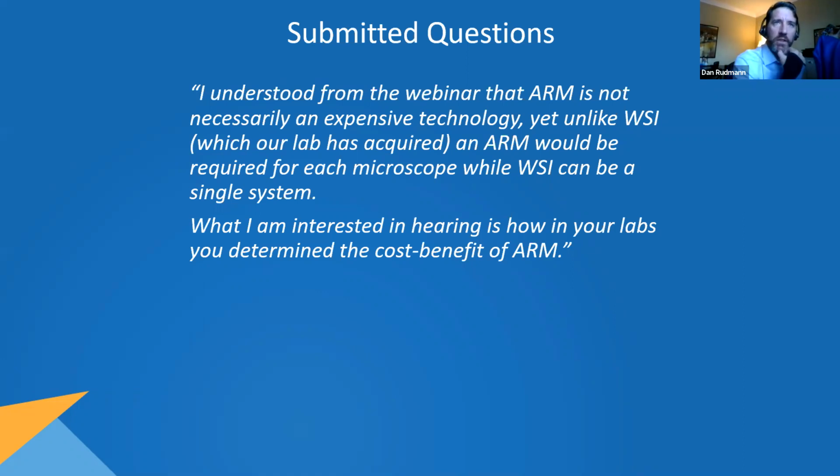So yeah, if you can access a system that works with your microscope that you've already invested in, that can use ARM, and then apply tools and algorithms that have been developed, then that's going to be much more cost effective for that kind of single pathologist practice. And in toxicologic pathology, there is a huge area. I mean, there's a large number of pathologists that work as single consultant entities out there, and to give them the opportunity to take advantage of ARM to help them in their practice would be very, very useful.